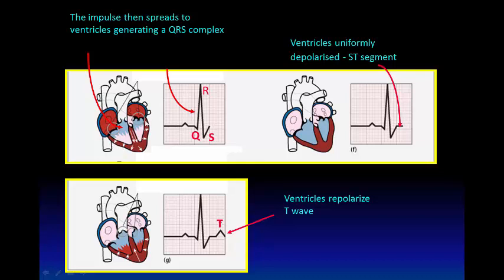Thus, the left ventricular activation will dominate, and this moves towards the active electrode, giving a positive deflection, a positive wave. So the needle moves up and then returns back, giving a deflection above the isoelectric line. So it is a positive deflection termed R wave.